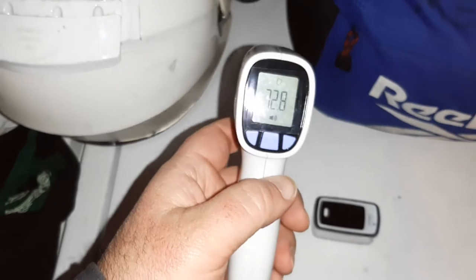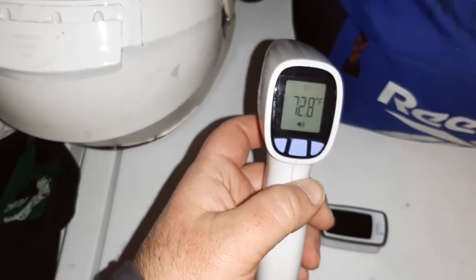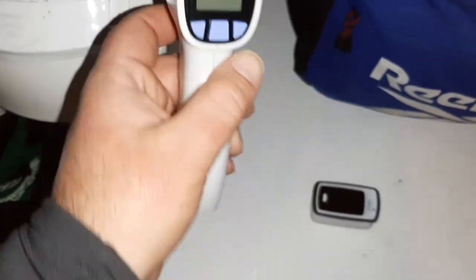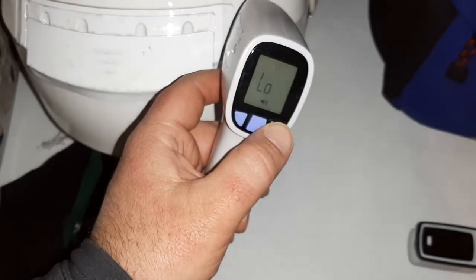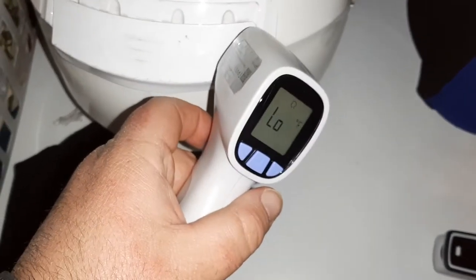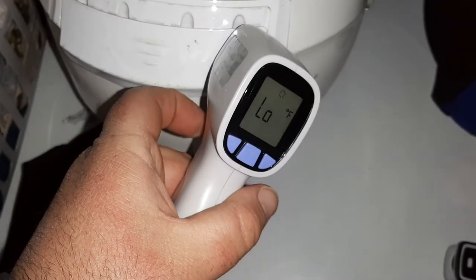And then obviously about a half an inch away from the person's forehead. I like to do the temple or sometimes the ear — I think the reading comes out more accurately that way. If you don't like that annoying beeping noise, you're on set and you want to be quiet, go into stealth mode — just push this button right here. The sound is now off because the speaker's off.